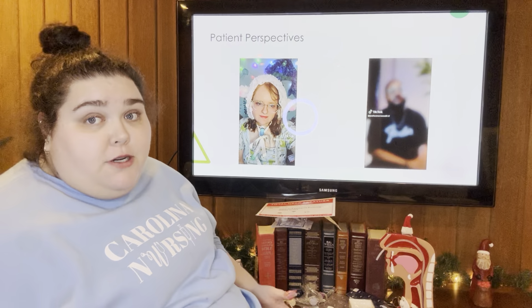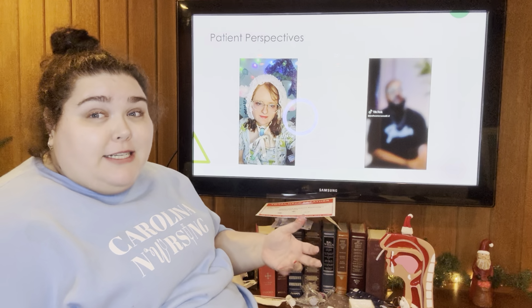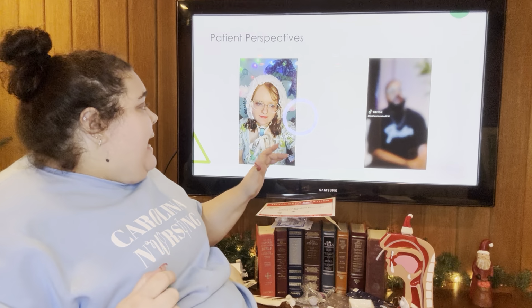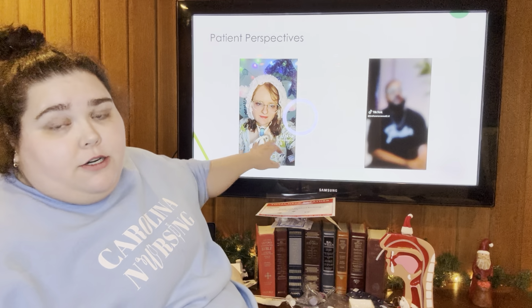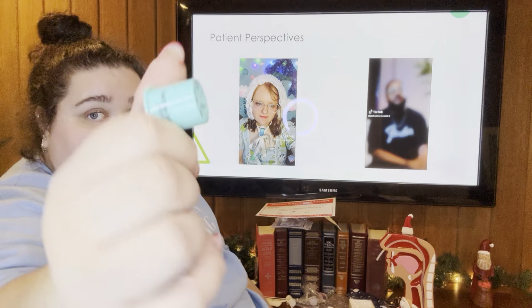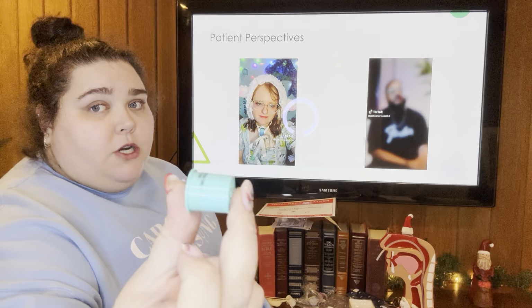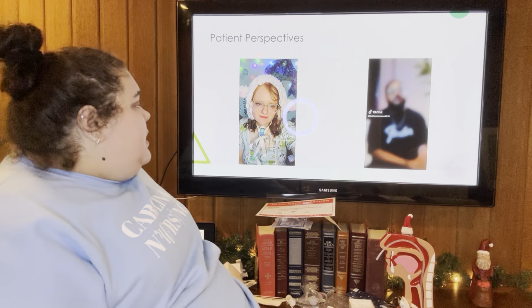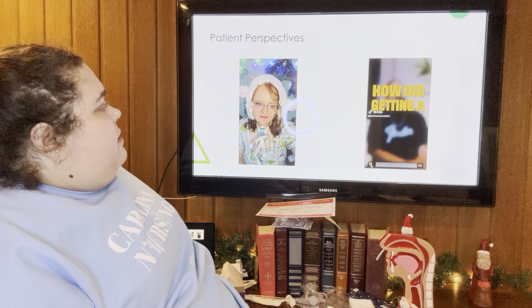So that's one patient perspective. I think it's important to kind of understand the different perspectives and the different whys people have trachs. She also has, if you can see, I'm not sure how well you can see, this little blue thing on her trach here. This is a different kind of passy-muir valve. This is one that is used inline with a ventilator, but we don't see them almost ever. So we've got one more patient story, and that will be all.